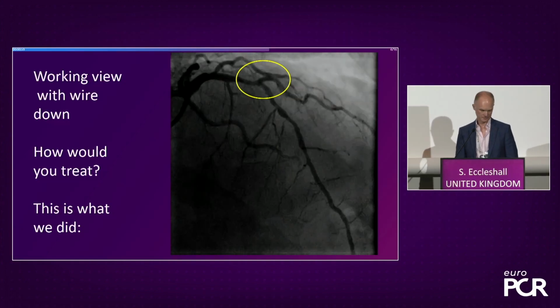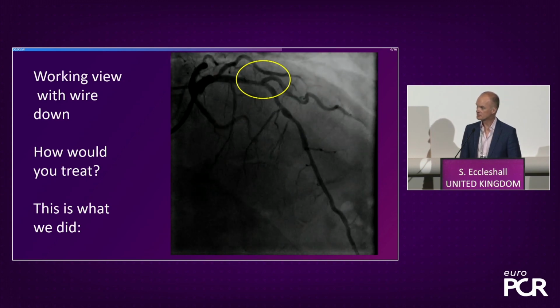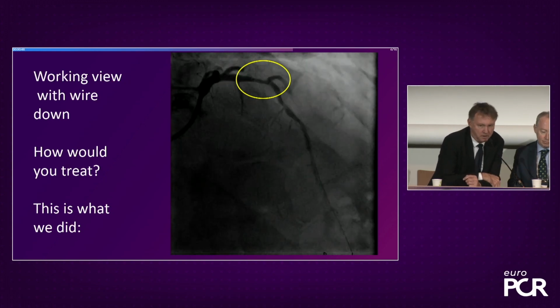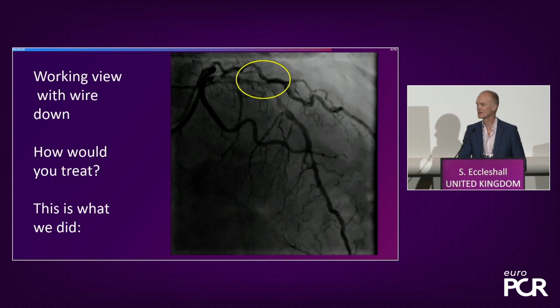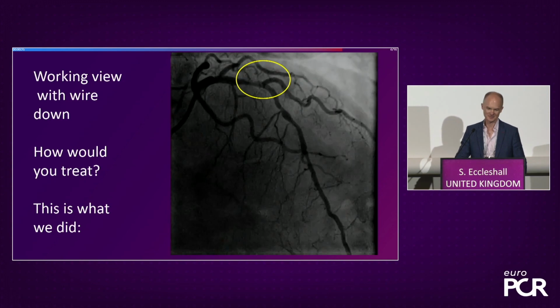So would you wire the diagonal? Does it make a difference whether you're stenting or ballooning as to whether you're going to wire the diagonal? Perhaps no touching the diagonal. Don't touch it, whether it's a balloon or a stent? Yeah. So one wire? One. Okay. But who would wire the diagonal? Who would definitely not? I'll wire it only if it is a stent, not with the drug. Interesting. This is a drug-eluting balloon session, so it's a bit of a giveaway, but yeah, you're right. But it's a great point, isn't it? It's an important point, absolutely. Very good point.